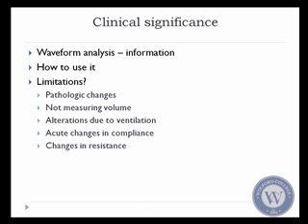You can also see clinically that ventilation can significantly impact your measurements of your heart. Remember that negative inspiration as well as positive pressure ventilation may actually alter the cardiac performance and the ventricular compliance of the heart. As a consequence, you do get changes in pressure readings simply due to alterations in breathing patterns, which have nothing to do with actual cardiac performance, but actually have to do with pulmonary health. You can also see acute changes in compliance due to ischemia or multiple events, which we'll talk about in time, and you can also see changes in resistance.